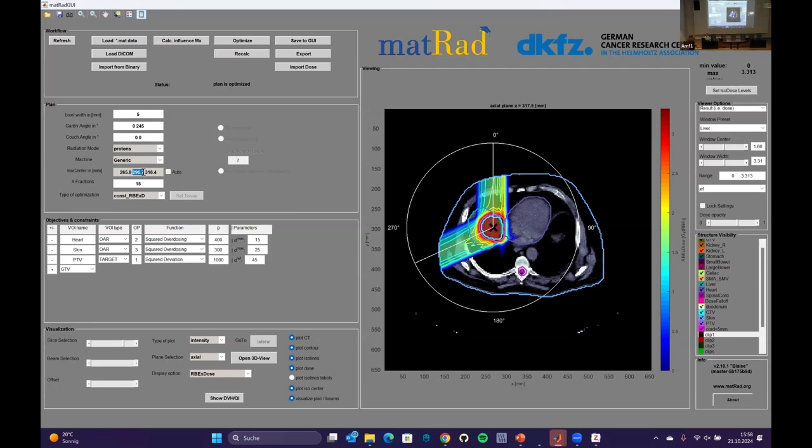There was a question: is there robustness when we are optimizing? So we do not robustly optimize. Robust optimization is a little bit more computationally challenging, and since we are usually constrained by laptops, I do not want you to load 27 proton doses at the same time. I don't know if everybody has 32 or better 64 gigabytes of memory on their laptop. So it becomes a little bit challenging to do this live, but I will try with an example of the new matRad version later.